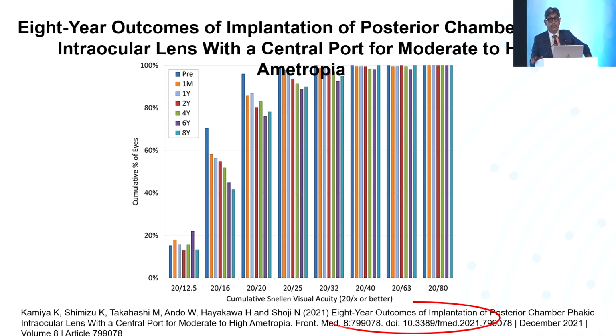This study came in 2021 with the centraflow design. In the pre-centraflow era, the ICL results were different, and in the post-centraflow era, the ICL results have become much better, the chances of development of cataract have decreased, and the patient's comfort is much higher. And you see, this is an 8-year study post centraflow in moderate to high myopia cases. These colorful bars are of 8 years, and the vision post-surgery at the end of the first year is the same at the end of 7 years. Their height is almost the same. So there is no change in refraction and no change in the vision after this.